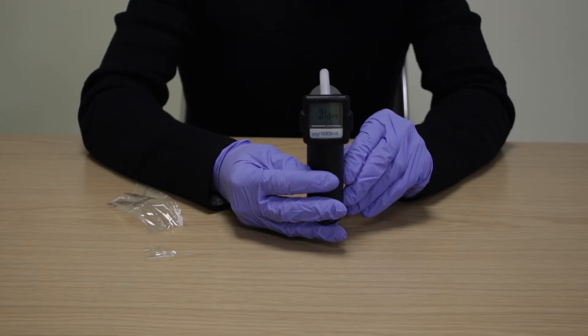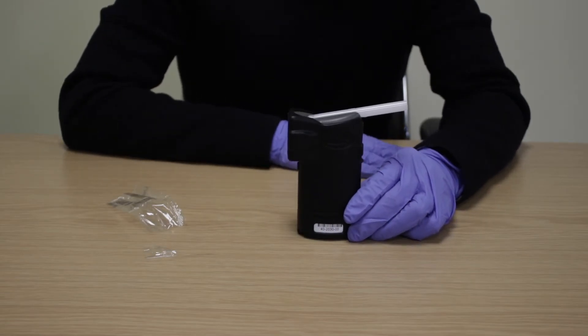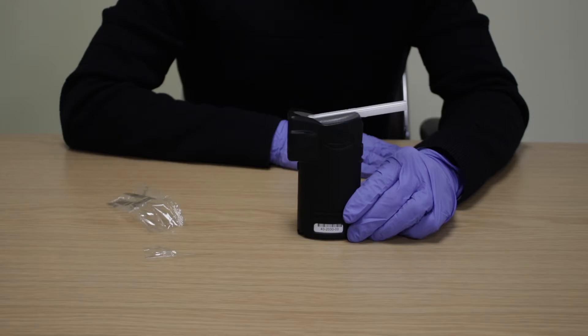The AlkaSensor FST is designed to operate between 0 and 50 degrees Celsius. If the device is out of this range, it will indicate an error message and power off. Always bring the AlkaSensor FST up to room temperature whenever possible before use. If the device is to be used in extreme temperatures, try to ensure it is within range by keeping it protected.